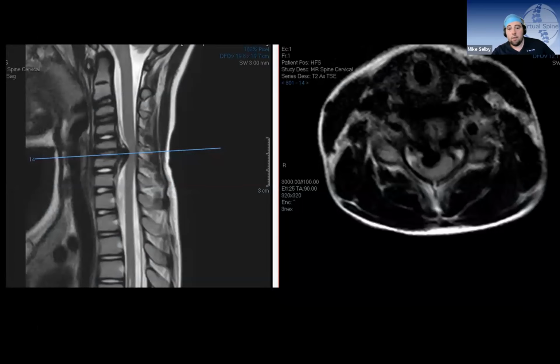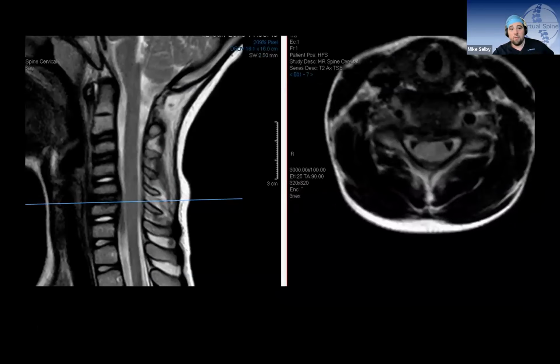That's the MR sliced through there. He was in a pinless halo for about 3 months, and eventually I let him go home from hospital. That's his follow-up MRI 3 months later. We tapered his dexamethasone while he was still in hospital. His neurological function actually improved, and this is a three-month outcome. I just thought if people haven't seen this before, it's worth having a look at it.